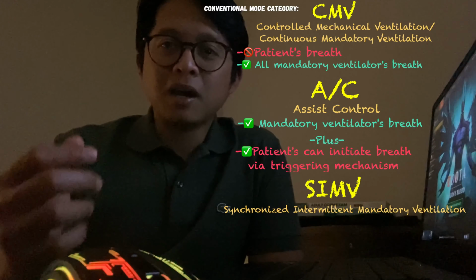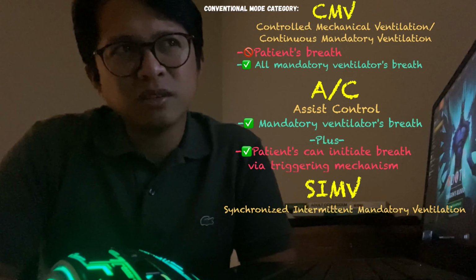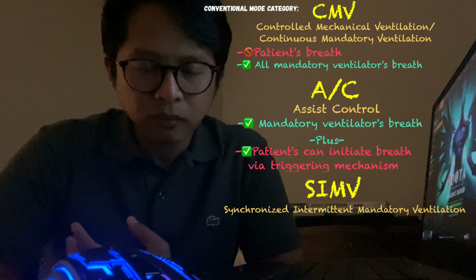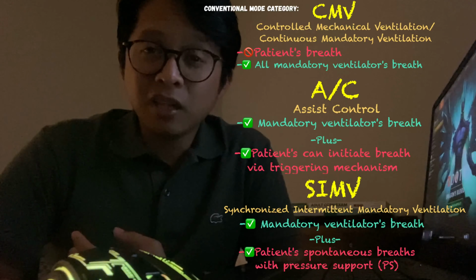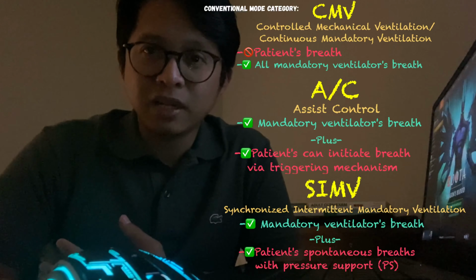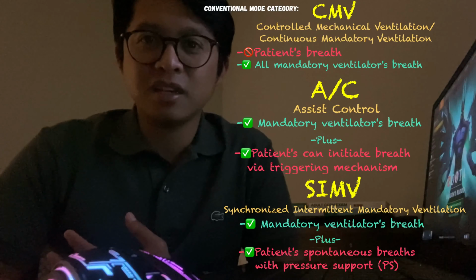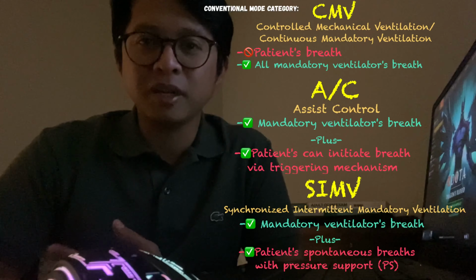SIMV is the hybrid variation of intermittent mandatory ventilation, or IMV, which is, I think, obsolete already. For example, in this SIMV mode, you set the ventilator to give a set tidal volume and flow rate every 10 seconds. So that is 6 mandatory breaths per minute, right? Or an RR of 6 per minute.